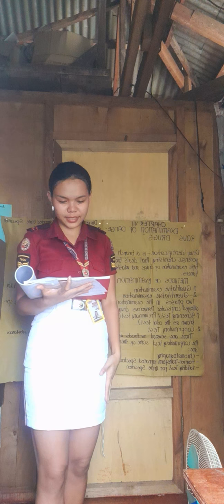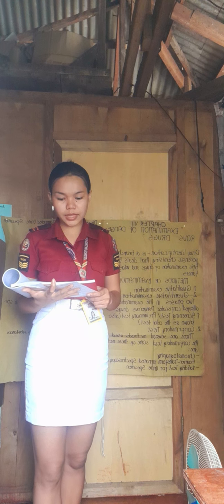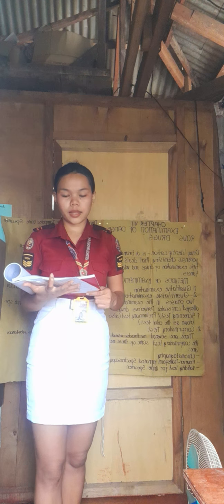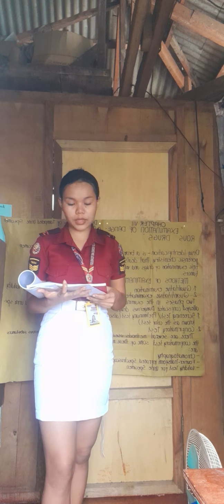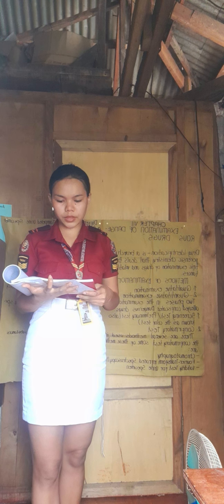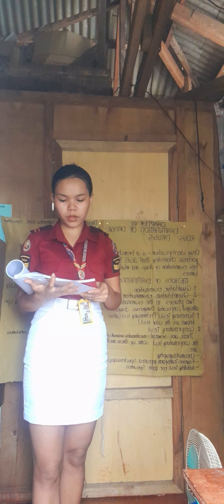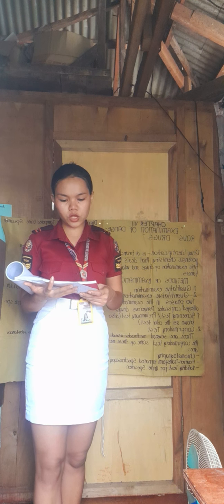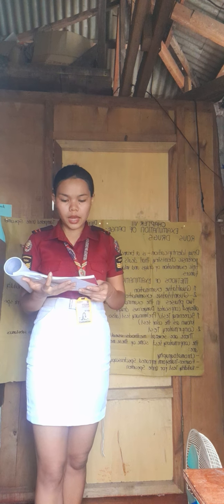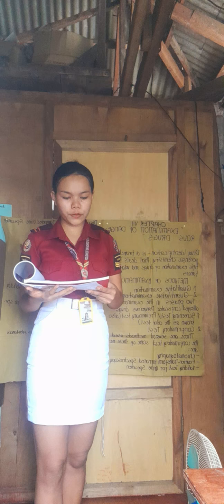Next is validity test for urine specimen. Validity test is conducted to determine the integrity of the samples. Reasons for conducting validity tests. So in case of unobserved urine, when there is suspicion that the urine specimen has been tampered. So instances when to allow unobserved urine specimen collection.